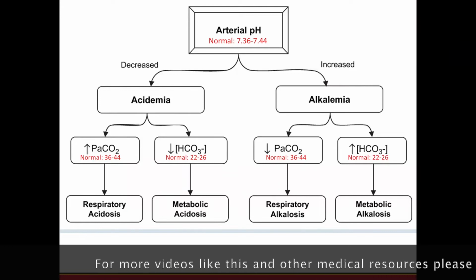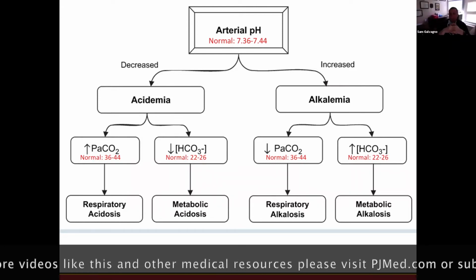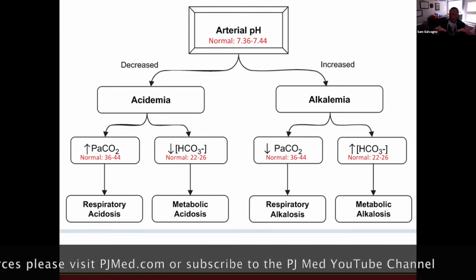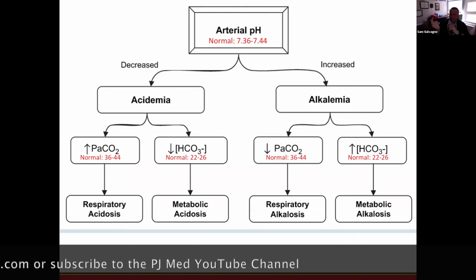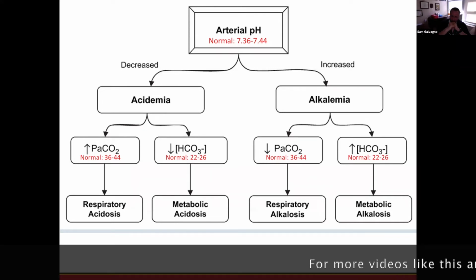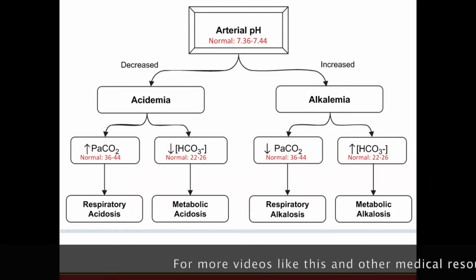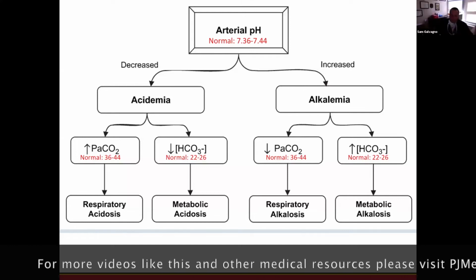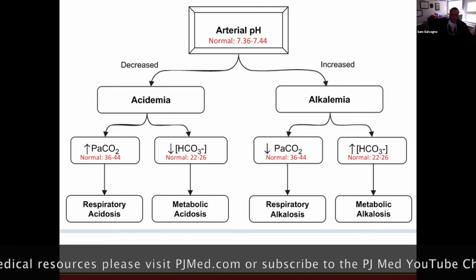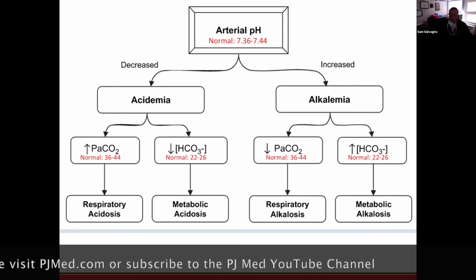Hypoventilation. That's a big one, yes. And in this case, that's probably what's going on because remember, we were only ventilating at a rate of 12. So hypoventilation is a good one, sure. What else? Altitude. Oh, okay, yeah. Altitude will definitely affect your oxygenation more, but you can have some dead space occurring.